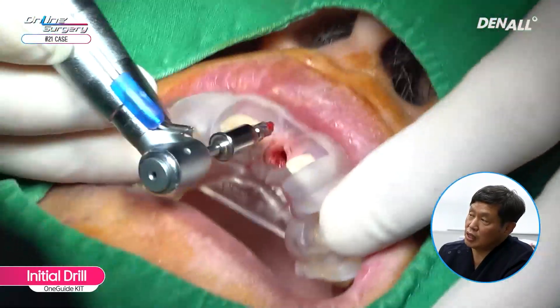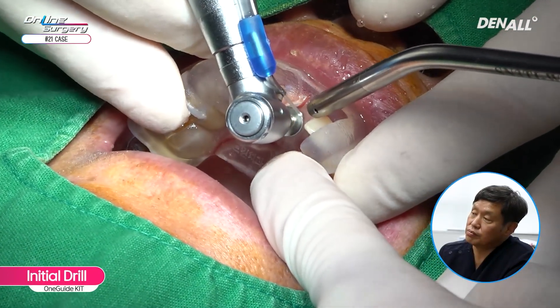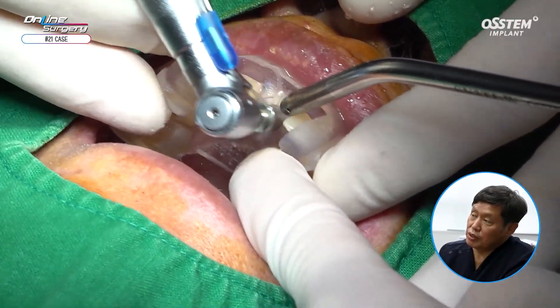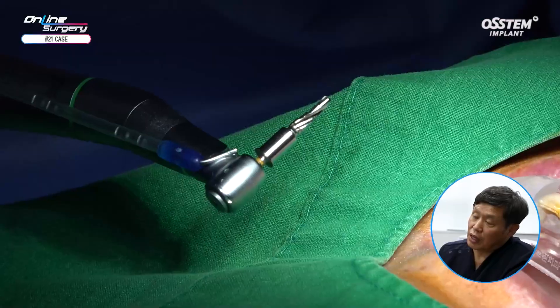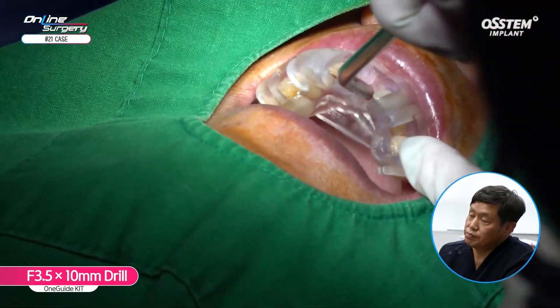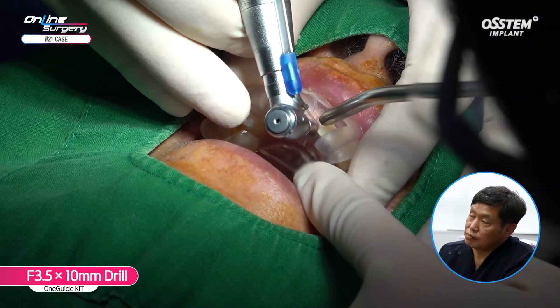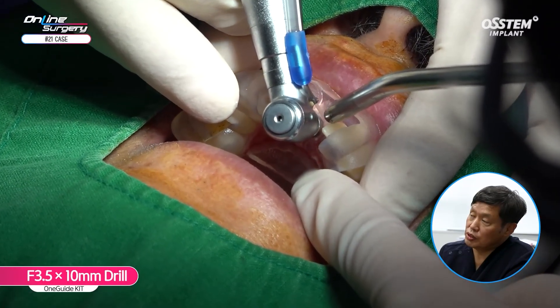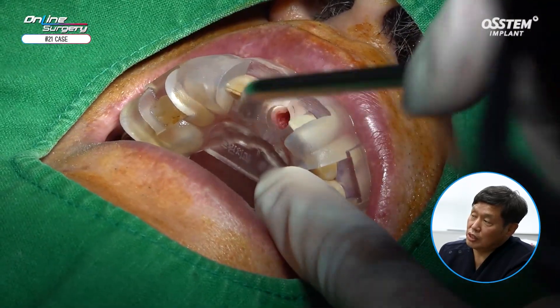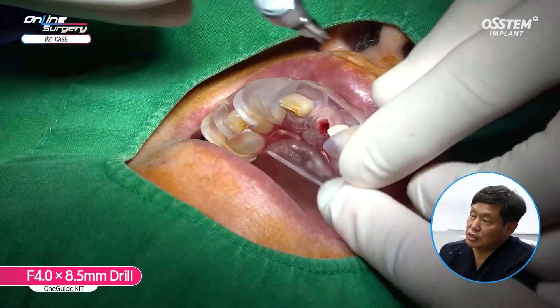We did not use a path drill or other special tools and proceeded with the initial drill. Since we planned a 10 mm implant, we followed with a 3.5 mm by 10 mm drill. To enhance primary stability, we limited the 4.0 mm drill to a depth of 8.5 mm.